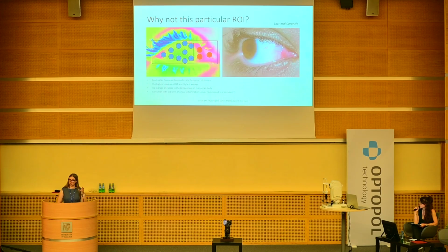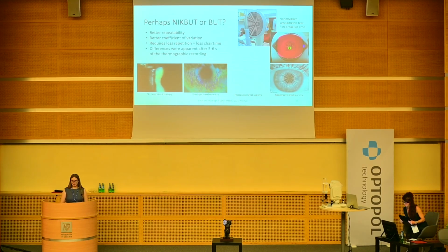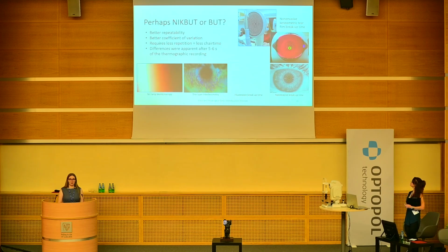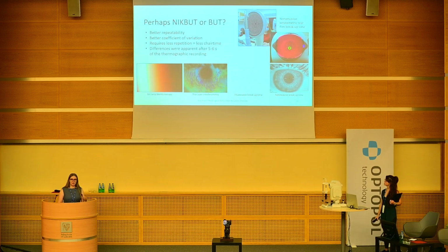If you look to diagnose dry eye disease, you should go to the areas that are near the eyelid margin. And why not NIBUT? I really like NIBUT as a clinician to use as tear film breakup time, but if you ever measured tear film breakup time, you know that you have to measure it 2-3 times, sometimes even more, to have a specific diagnosis. It depends, of course, what devices you're using.